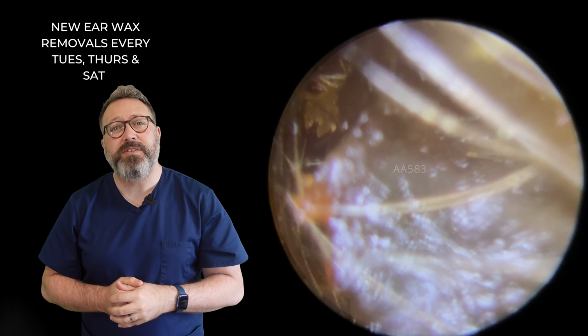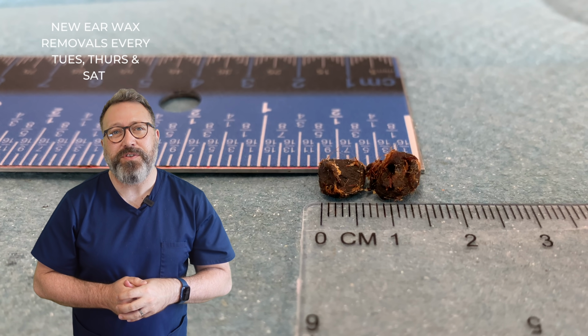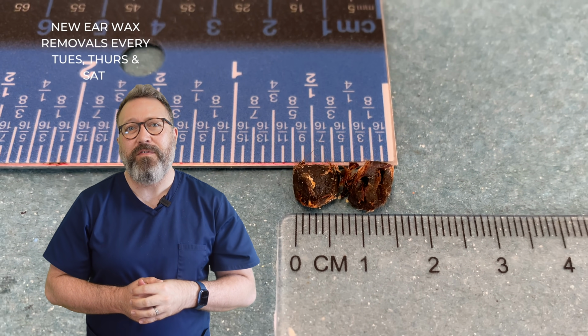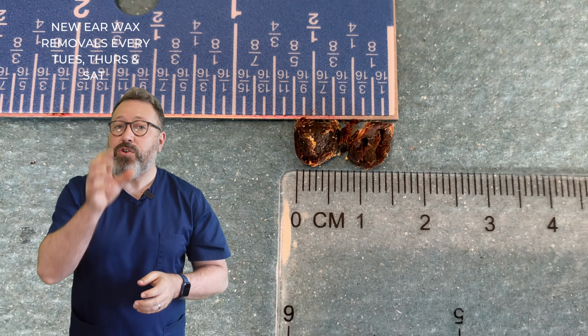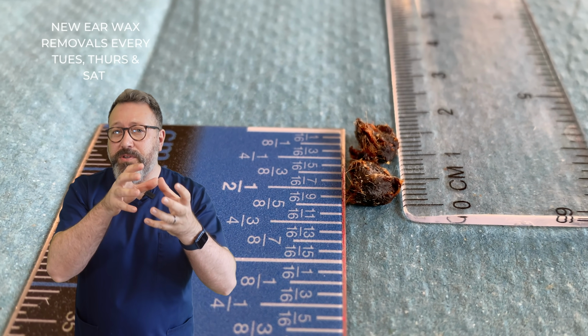So this is what it looked like at the start. And this is what it looks like at the end. So you can see a massive difference there as well. So pretty similar size pieces of wax there. So we've got, what, 1.5 centimeters, sort of 5/8 of an inch there. So quite big pieces in themselves, not completely blocking the ear canal, both sitting right at the entrance.